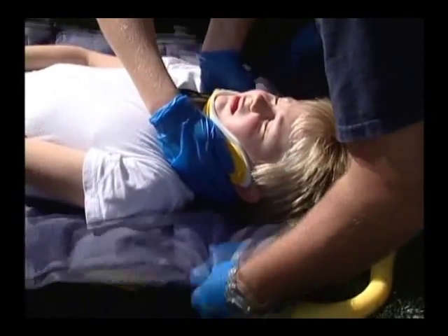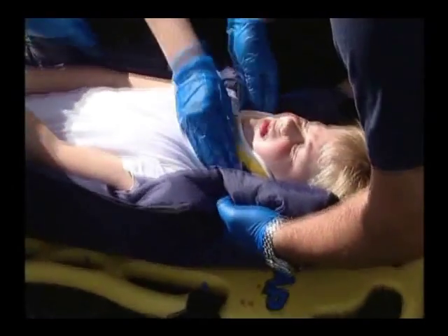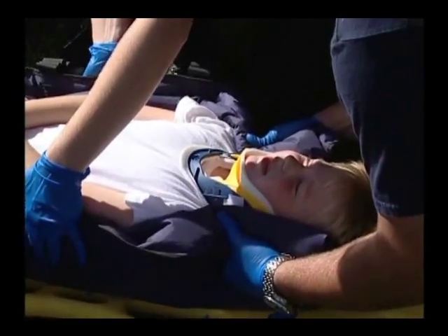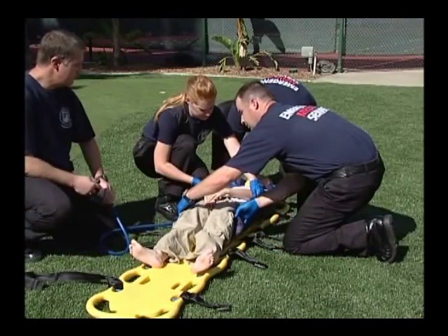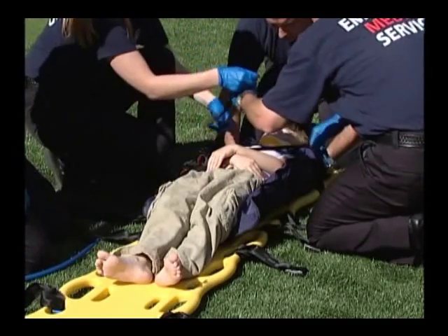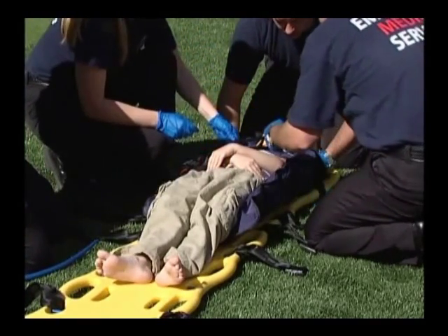Use your hands to mold the evacu-splint around the patient's head and shoulders, just as we did with the adult head immobilizer application. Evacuate the splint and then secure the patient to the backboard. The evacu-splint also acts as a thermal insulator, which is a real benefit when working with pediatric patients.